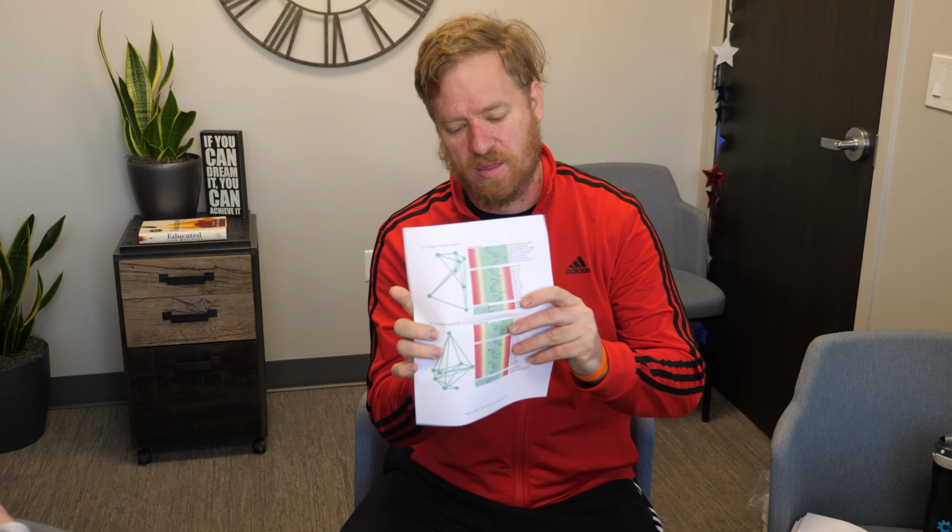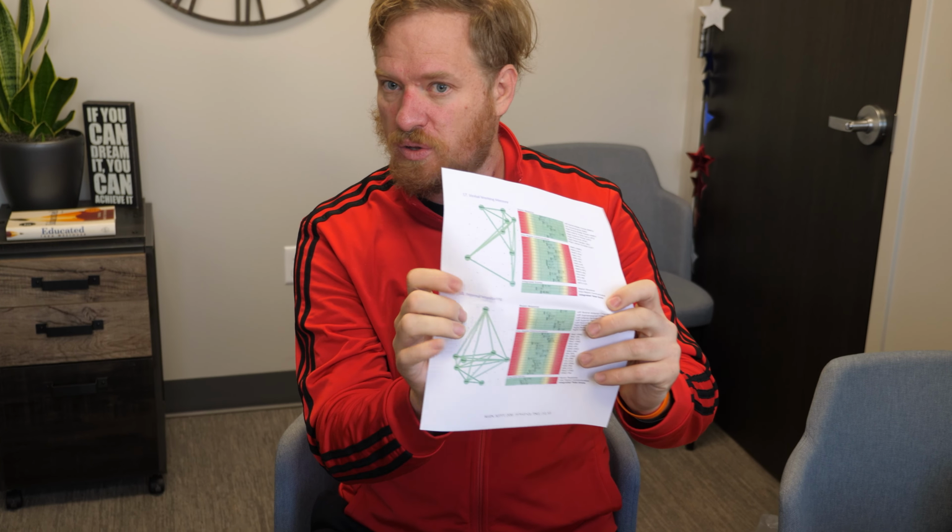This one's pretty good. So this is an example of one of the pages of the report, and this one is verbal working memory and internal monitoring, right? So those are two types of tasks. Functional system your brain uses to get through the day, essentially. Yeah. And there are two pieces to this, right? So there's region response, which, if I understand correctly, is there blood flow in the area, right? Is that part of the brain working? Yes, and how does that compare to our control group? Right. Exactly.